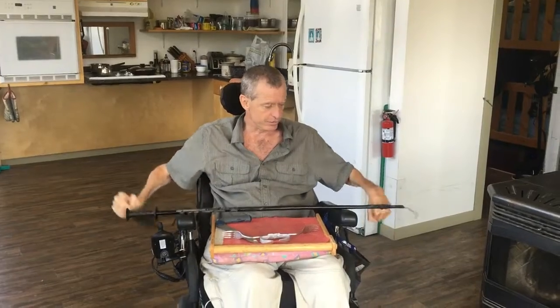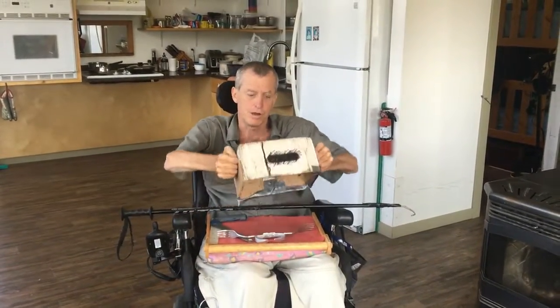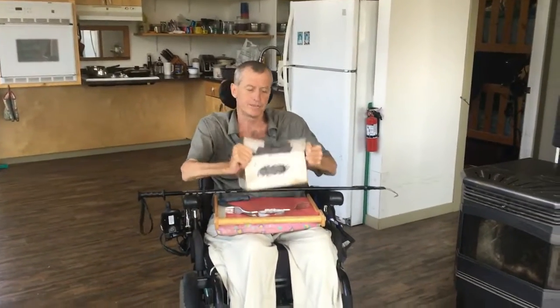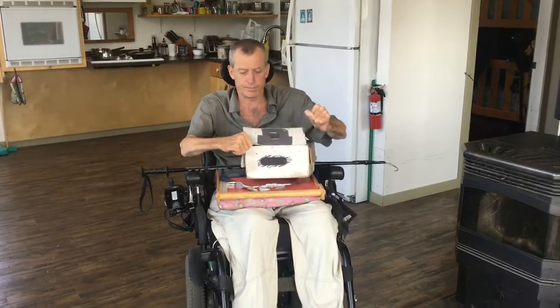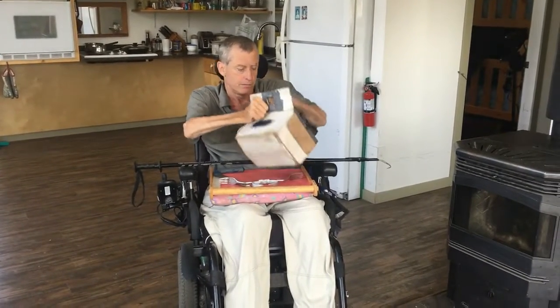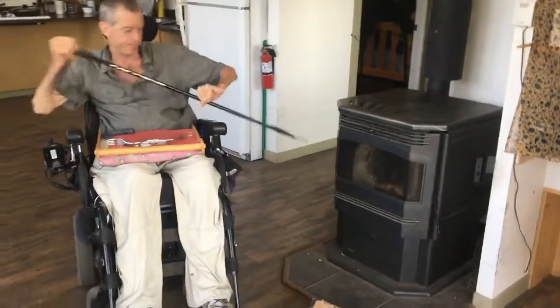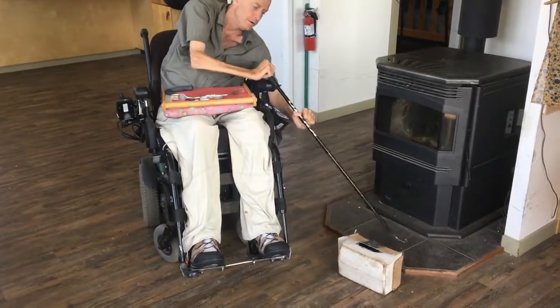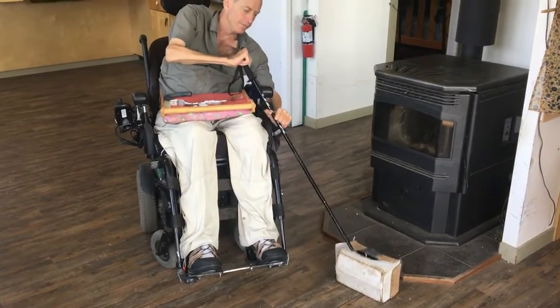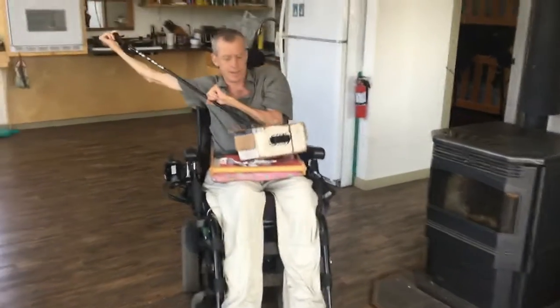And this one's good to use with this here cardboard box. And I just put a hole in one of the flaps on the top of it like that. So if I drop something on the floor, I just drop that down like that, push it over, sort of jam whatever I want in there, and go like that, bring it up, and there I have it.